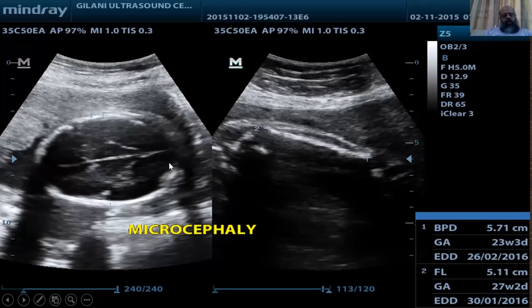We will also measure the head circumference. If it is also 23 weeks, 3 days, it will indicate that it is not a dolichocephaly, it is not a longer head in which the biparietal diameter decreases and occipitofrontal diameter increases. So head circumference will be important to measure in such cases. And here we will also take the abdominal circumference in order to rule out large long bones. Sometimes there are larger long bones in some of the ethnic groups.